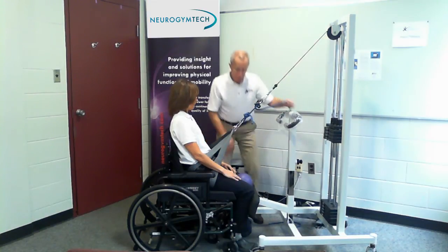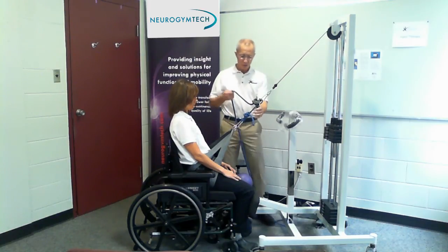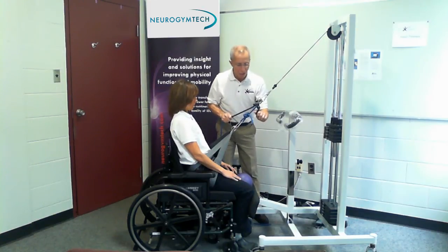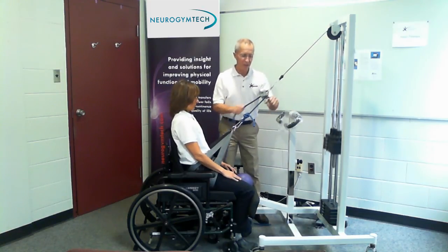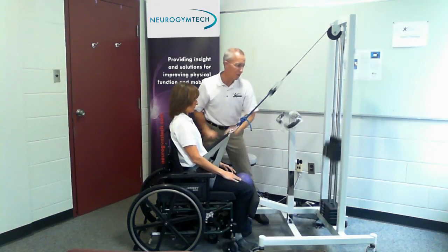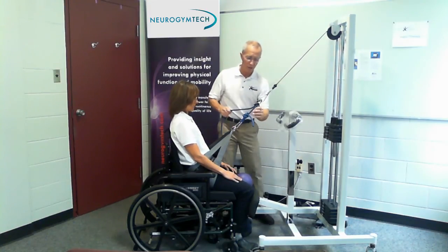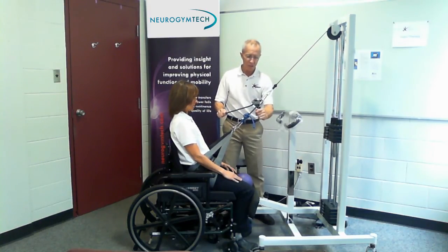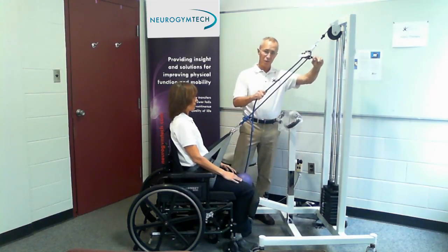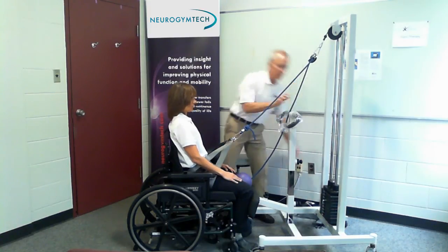Now I want to show you how to disengage the weights. With the free end of the rope, you're going to hold with one hand and lift up on this lever. When you lift it like this, it enables you to release the weights. I'd like you to stop the video a few times and try this on your own. I'm lifting up on this lever and controlling the descent of the weights with my other hand. Then you can change to take more or less weights.